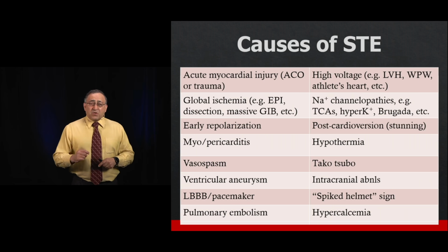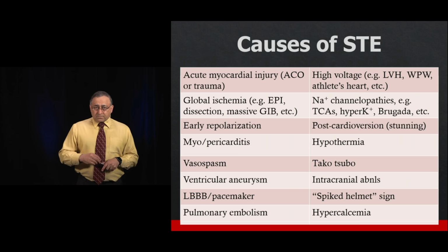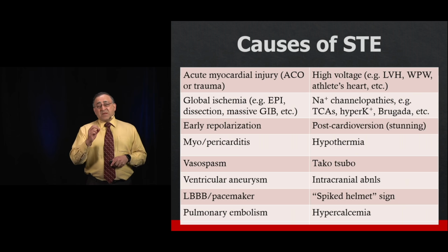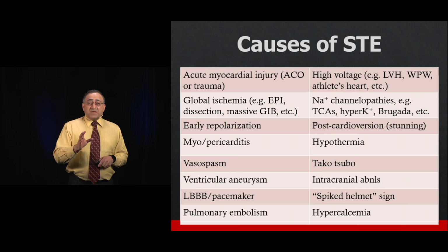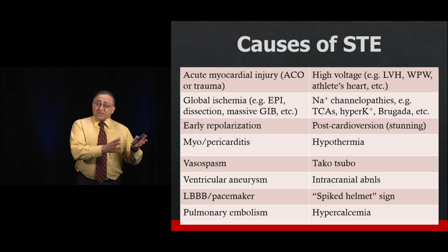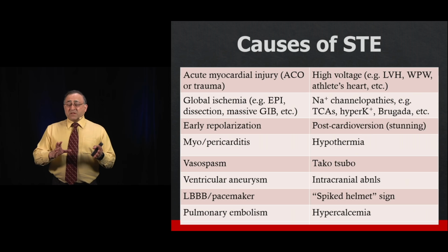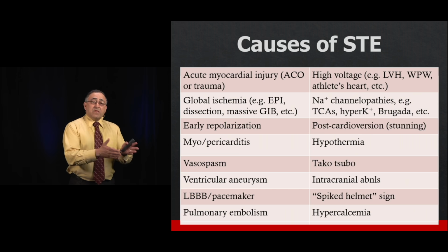Your history and physical are extremely important to trying to figure things out. But it's not always just the history and physical. Sometimes there are subtle things on the ECG in the presence of ST elevation, or maybe the morphology of the ST elevation, which can point you in the right direction. We're going to talk about a few specific scenarios. Those of you that joined us for the ECG workshop will recognize a little bit of this, but we're going to go a little bit beyond what we talked about in the ECG workshop also.